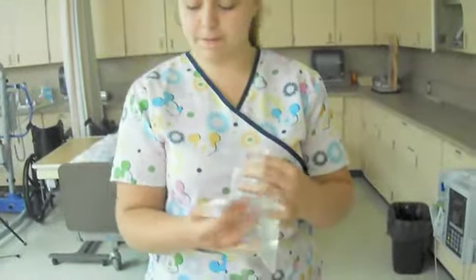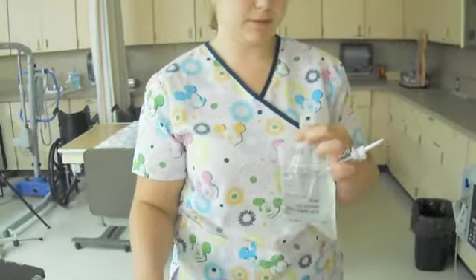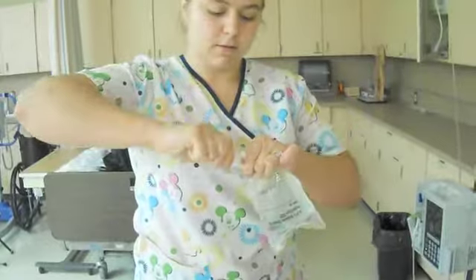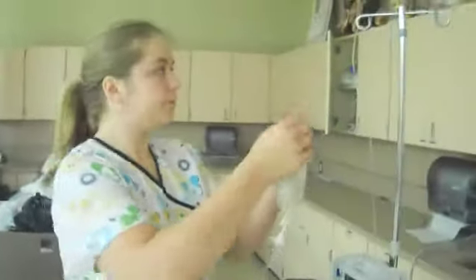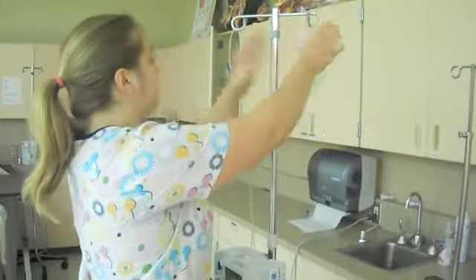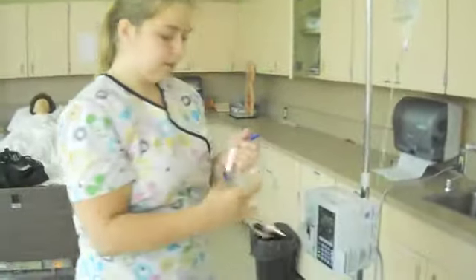We're just going to spike the bag with our new setting, and also make sure that it's clamped by pushing that white button. Bring that in. I'm just setting it up there. This line — just continue it.